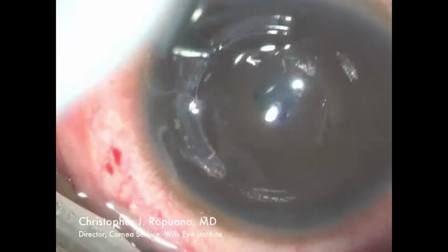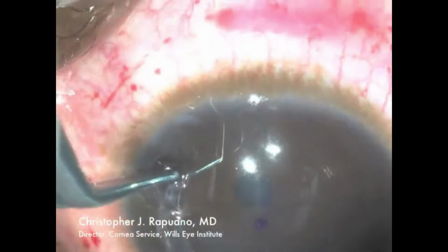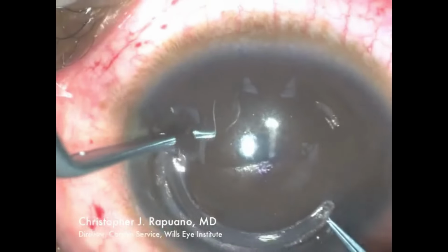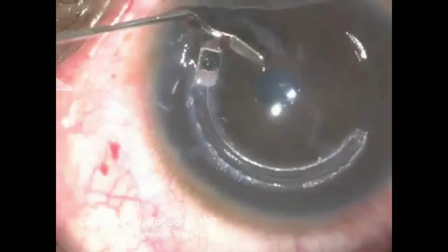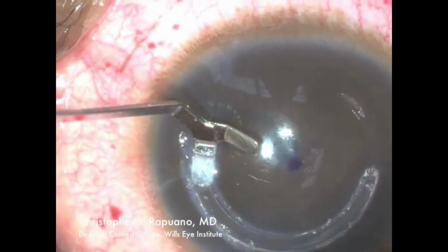The lamellar dissection with the femtosecond laser is done at approximately 65 to 75% depth. It's often tricky to get the Intacs segment all the way in because you're pushing it around a circle. Here it's almost all the way; sometimes a second instrument is used to push the end down. The near end is then pushed in a little bit further so it doesn't sit right next to the wound.